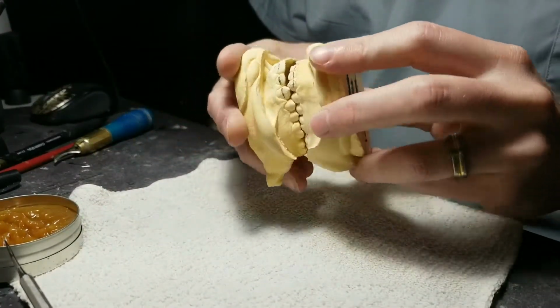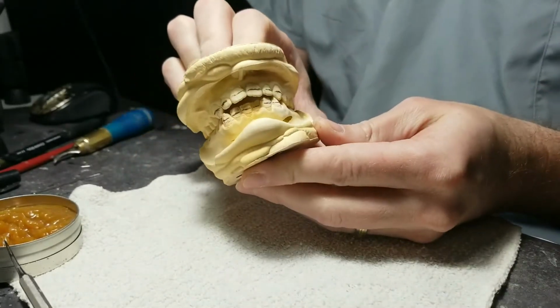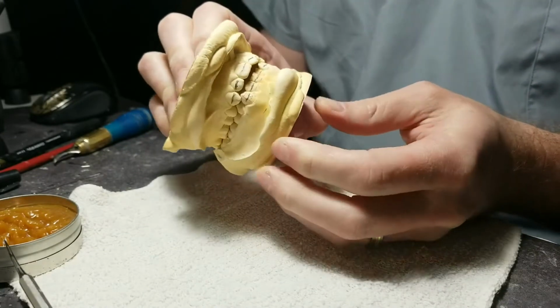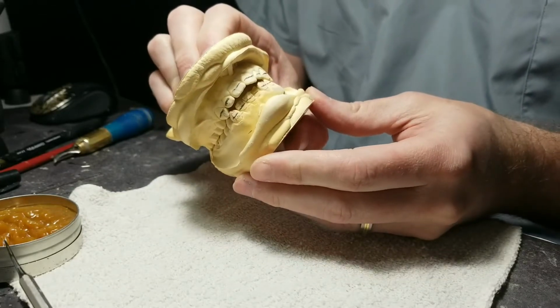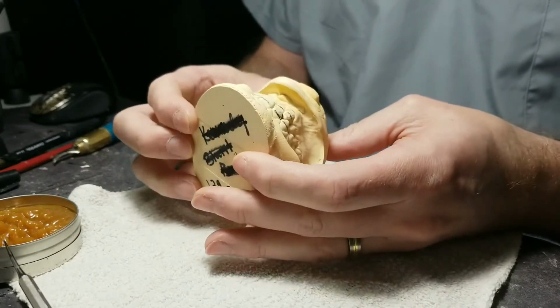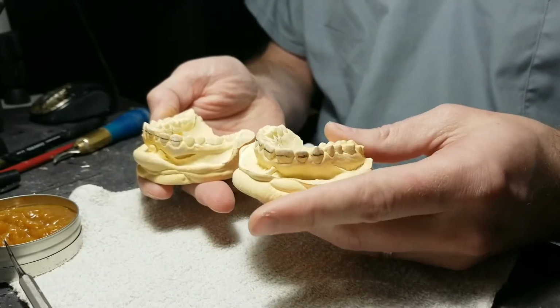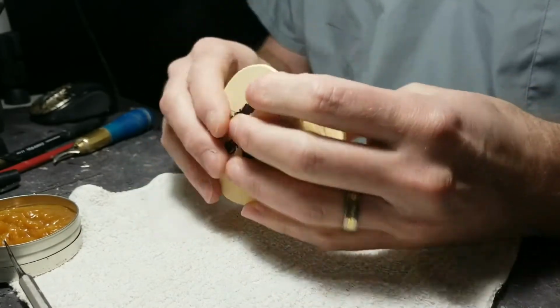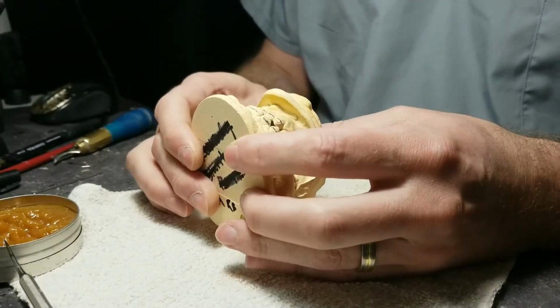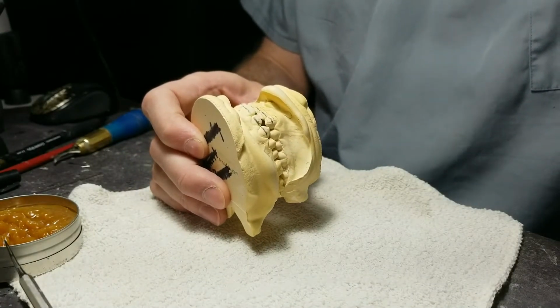Okay, so today it's kind of unusual. I thought I'd film it. We are going to reset. I got instructions. I'm making upper and lower spring retainers, and I got instructions to reset to ideal. And look at this open bite. It is crazy. So I'm going to do my best to try and reset this, and the doctor may just say, let's see what we can get with the spring retainers, and we go from there. His instructions were reset upper and lower to ideal, no stripping, and then making two spring aligners.